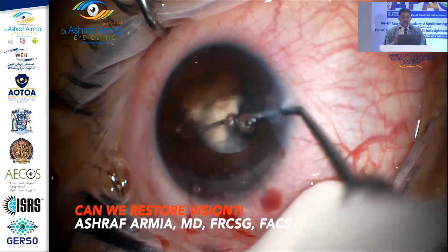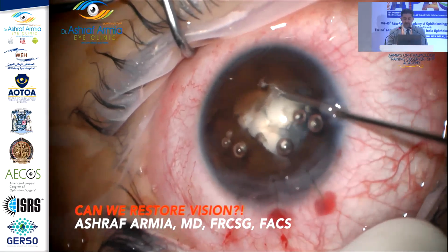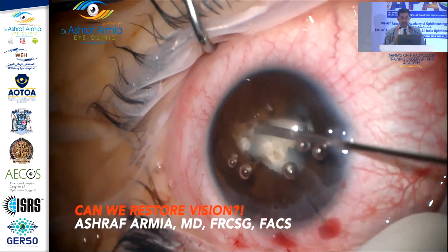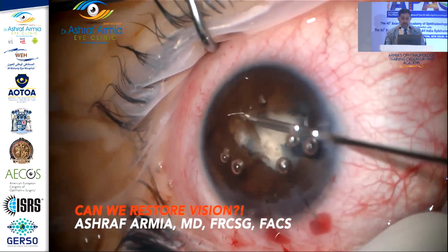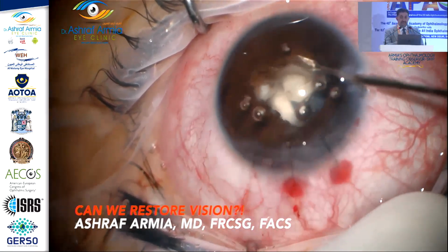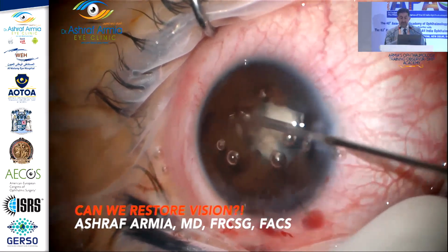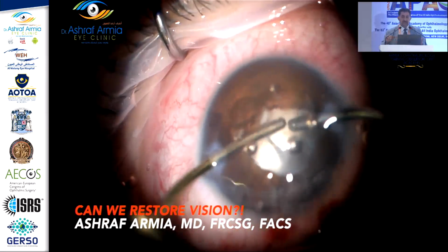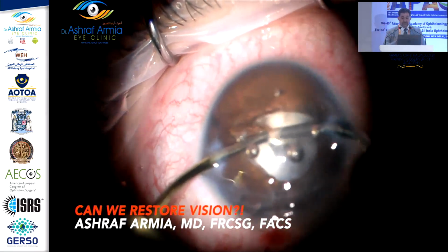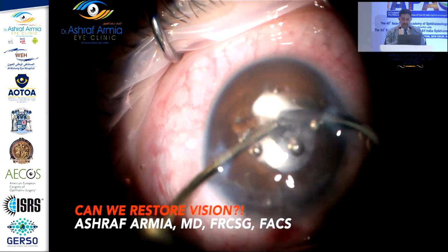It's an amalgam. I don't know what this is. Either it's an after cataract, it's anterior capsule, it's vitreous. I don't know. Really, I don't know. So with the micro forceps, micro instruments, this is important in these cases, like micro scissors, I'm trying to create or find again the sulcus level. So it takes time, it takes time. These cases, I put them last on my list to enjoy, because you cannot put a time limit. So I'm trying to find this amalgam.